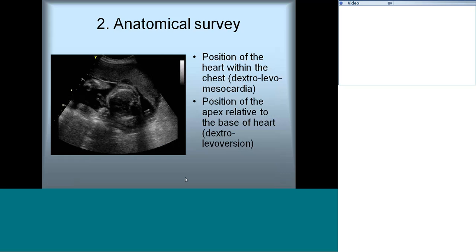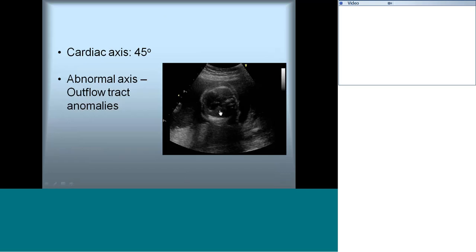The next important parameter is the cardiac axis — the angle between the line drawn across the interventricular septum and the line across the anteroposterior diameter of the chest. This angle should normally be 45 degrees plus or minus 15 degrees. Any abnormality in cardiac axis points toward heart disease, especially outflow tract anomalies.